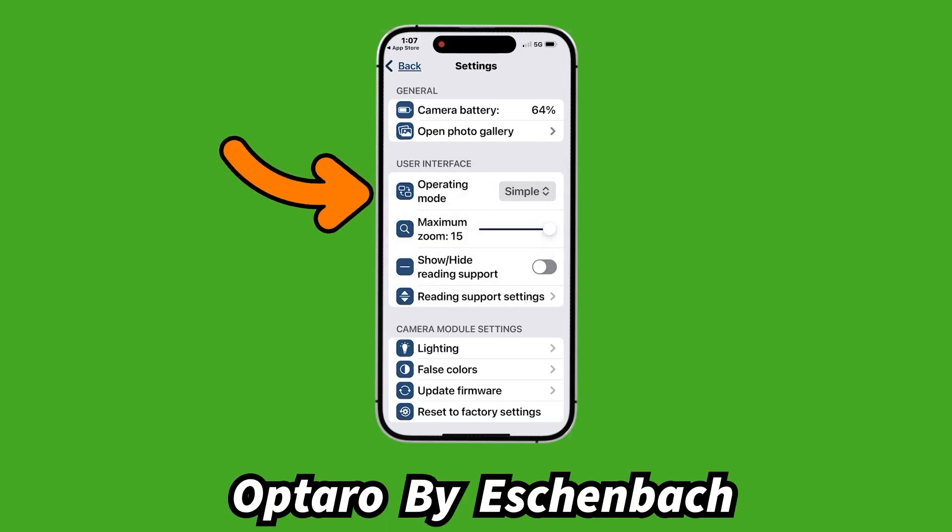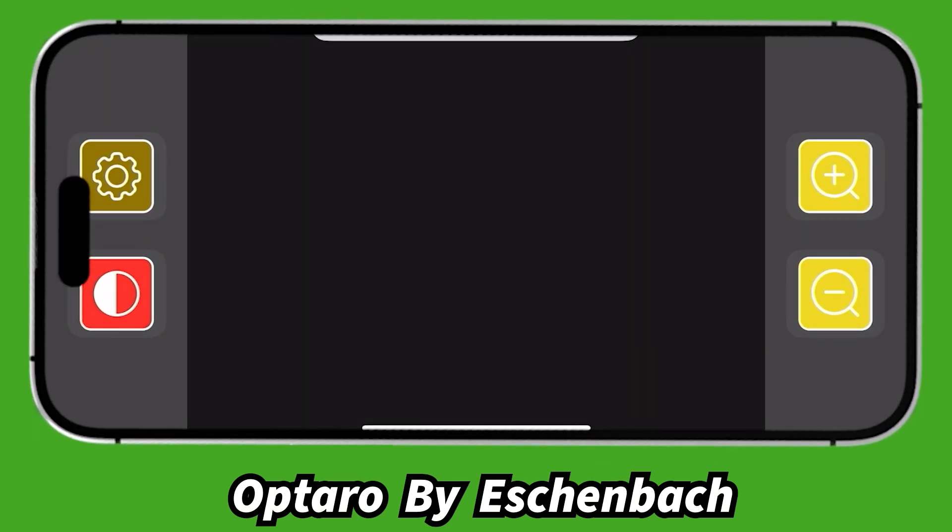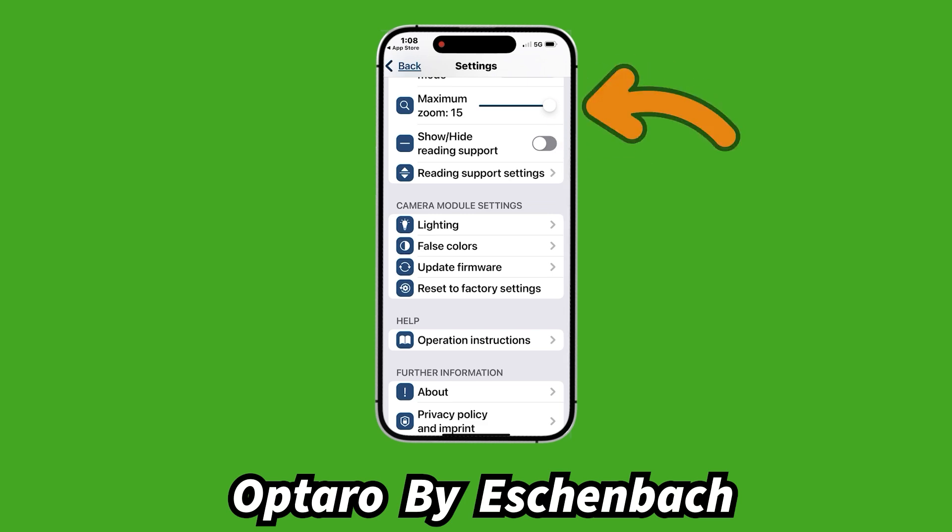The last thing to cover is the settings. When we hit the settings button, the phone shifts from landscape to portrait mode — the Optaro has its own stand to tilt the phone toward you. The first setting is operating mode. We've been in the advanced mode; switching to simple reduces the buttons to only four total — two on either side: settings menu, color button, plus, and minus. That's better for someone less confident with technology. We can also set the maximum zoom level — useful if you don't want someone accidentally zooming up too far and getting confused.